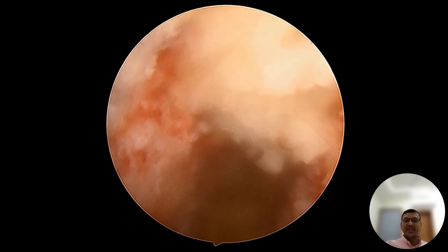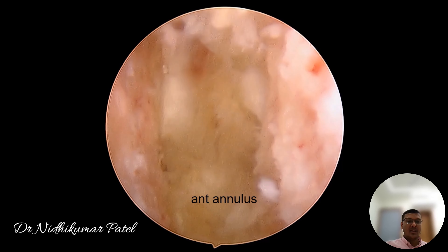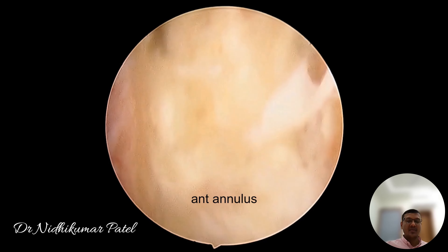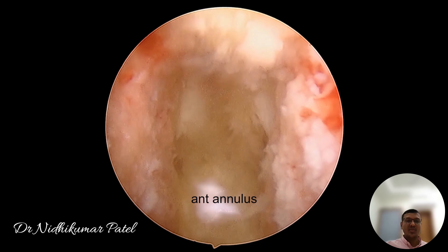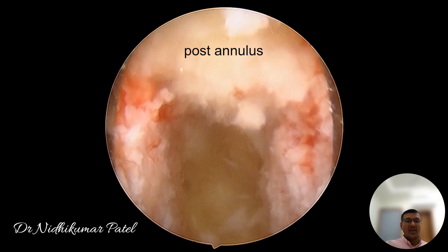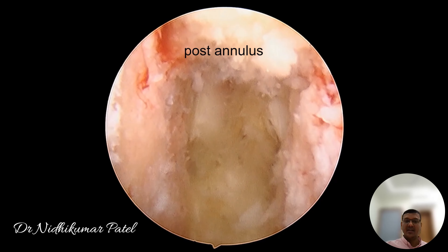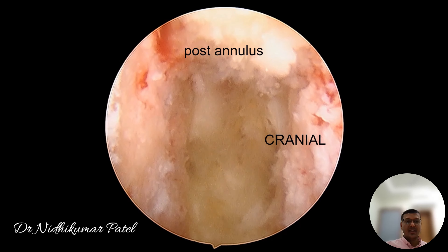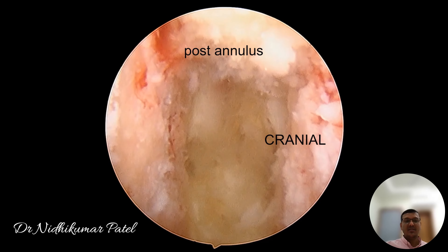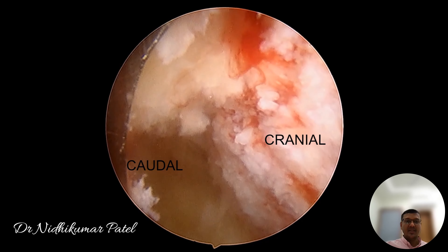The final endoscopic view looks like this: 3 o'clock is cranial, 9 o'clock is caudal. The deep structure is the anterior annulus. We are standing on the right side and the posterior annulus is at 12 o'clock. The advantage of the endoscope for fusion cases is that we can remove maximum disc material and prepare the end plates under direct vision without causing any injury to them, which is not possible by any other method.